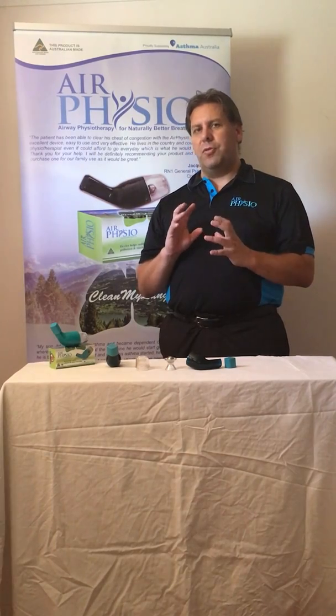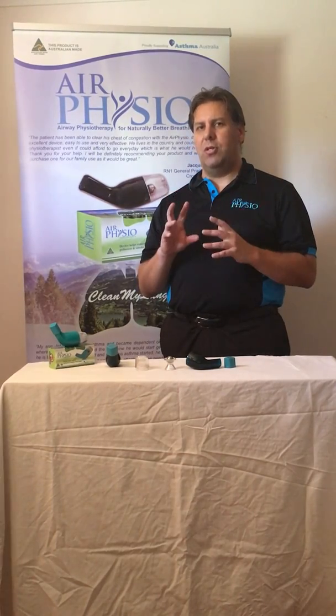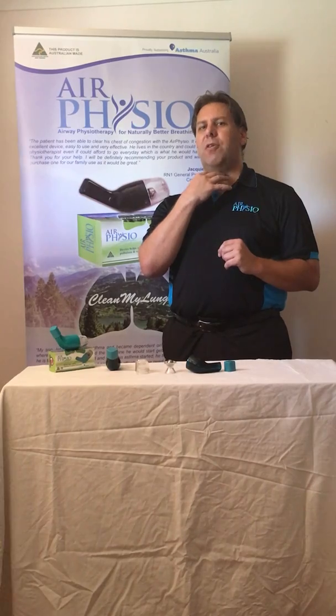This vibrates your airway walls and loosens the bond between mucus and the airway walls to help you clear mucus out of the actual airways. It then flows up through the airways with the back pressure into your throat and allows you to cough it out naturally.